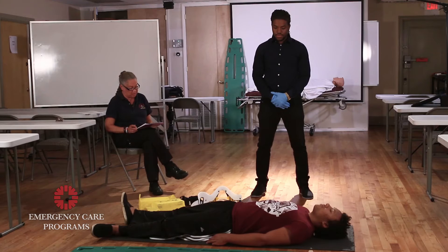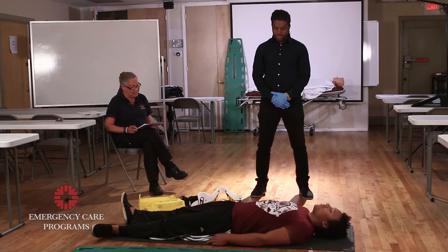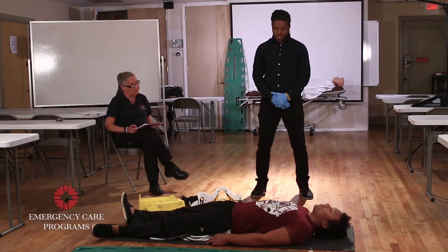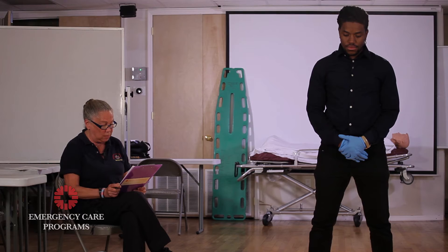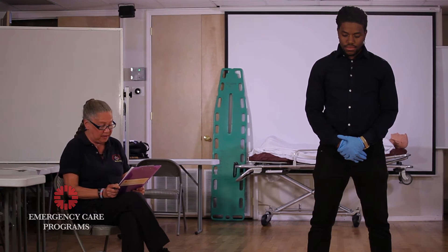You and your EMT assistant arrive on the scene of a motor vehicle crash. The scene is safe and there is only one patient. The assistant EMT has completed your initial assessment and there are no critical conditions requiring interventions. For the purpose of the station, the patient's vital signs will remain stable. You're required to treat the specific isolated problem of an unstable spine using a long spine immobilization device. When moving the patient to the device, you should use the help of the assistant EMT and the evaluator.